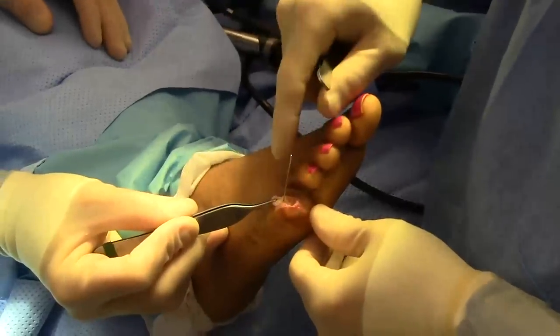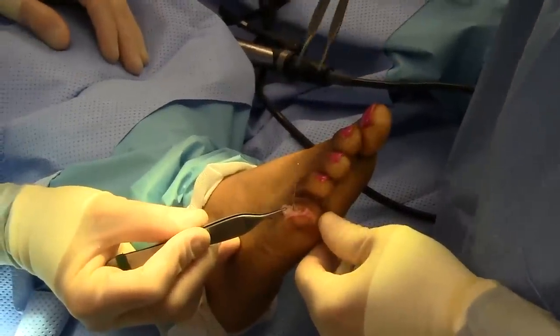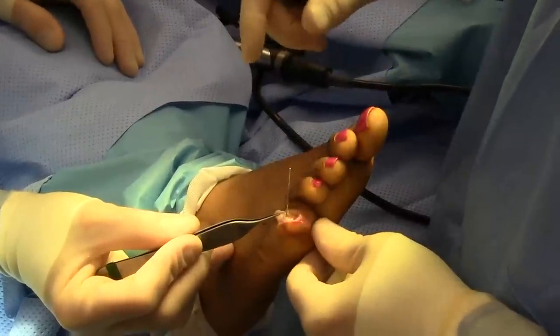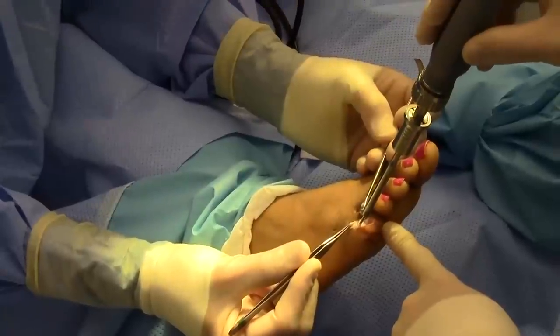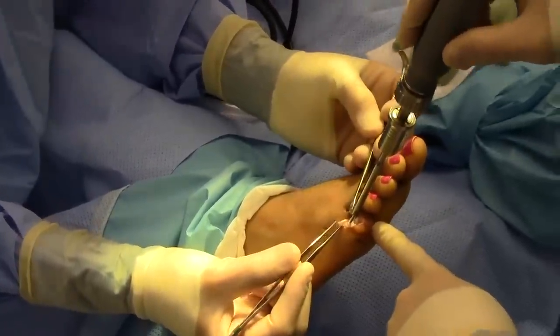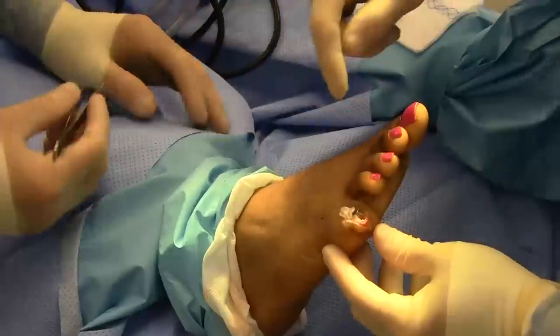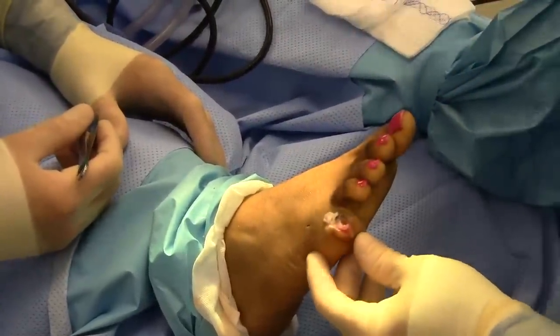The guide wire is placed into the proximal phalanx and we're going to thread the implant right over the guide wire, so it makes for a nice easy placement of the implant. The implant has been threaded over the guide wire and is about ready to put into the toe. The implant has been placed into the proximal phalanx very nicely over the guide wire.